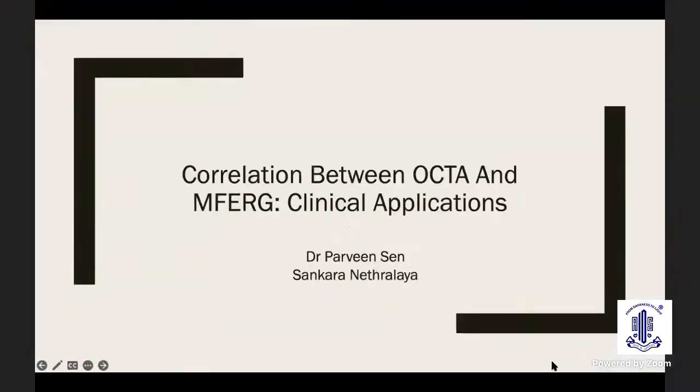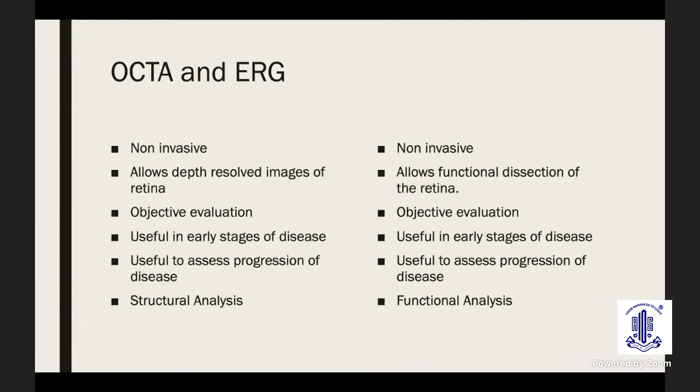So this is how we correlate the OCTA, which we have heard about the whole evening, with multifocal ERG. Why are we interested in correlating these two investigations? What is the similarity? Both of them are non-invasive. OCTA allows depth-resolved images of the retina, and the MFERG gives us the functional dissection of the retina.